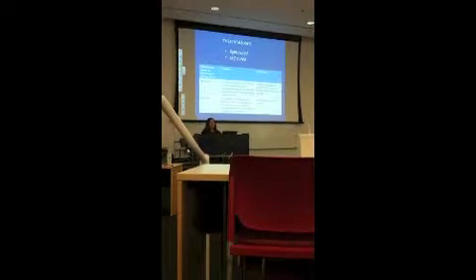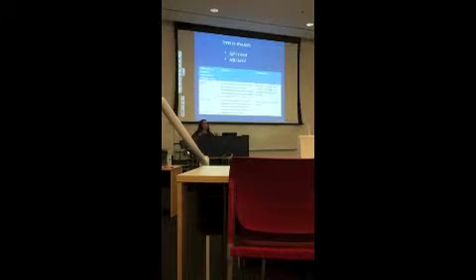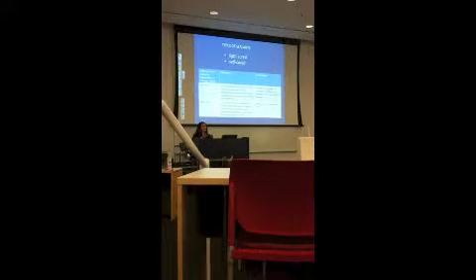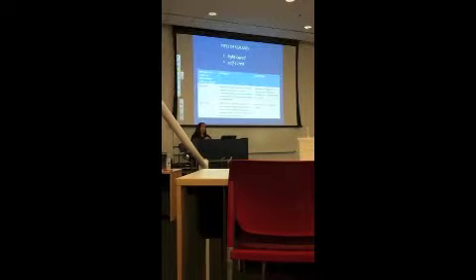The self-cured, the only time that I used a self-cured sealant, it's a sealant that has two parts to it that have to be mixed, like the Triage, which is used in St. Louis actually during Give Kids a Smile. And the reason why they use that one is because it is very forgiving as far as moisture. They actually encourage that you have some moisture on the tooth with that sealant.